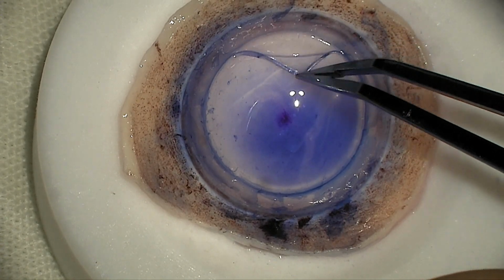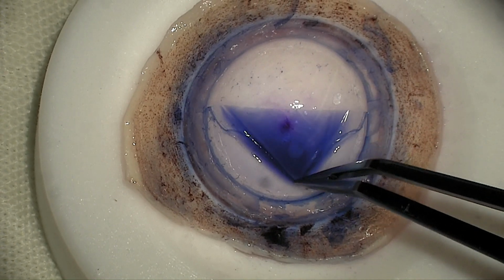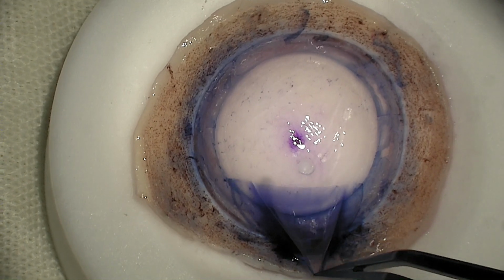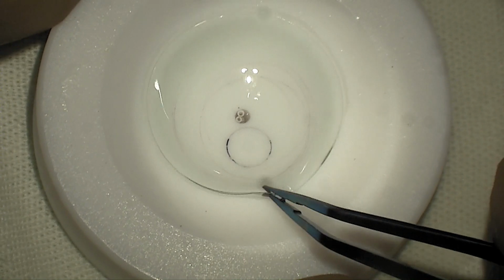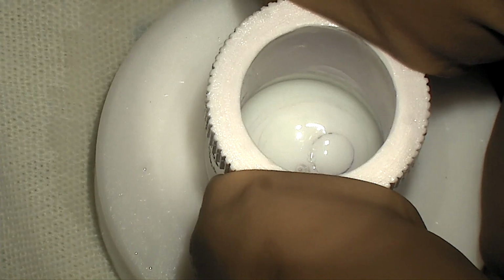Then, using McPherson forceps, the DM graft is gently peeled from the stroma almost entirely, leaving behind a 1 to 1.5 mm hinge. We then move to a second Teflon block where a BCL is placed and refined to 12 mm. Trimming it down to size helps in better air trapping.